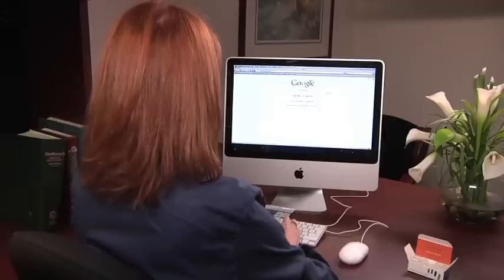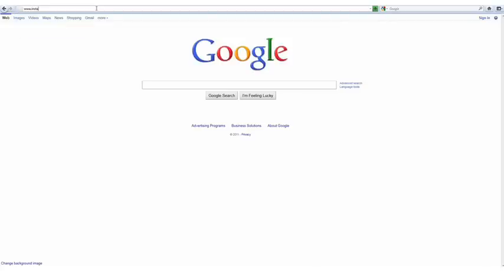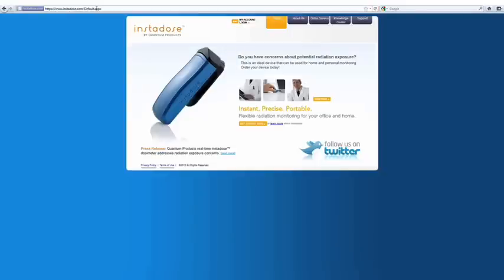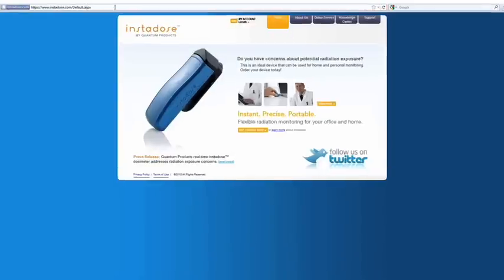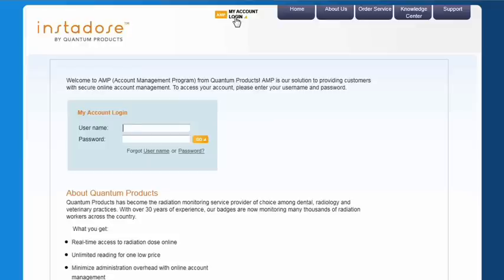Then type InstaDose.com into your web browser. Click on My Account Login, and enter your username and password found on the provided yellow card, and click Go.